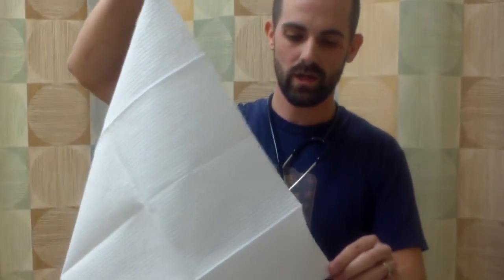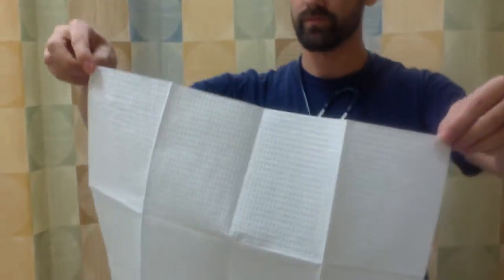Shake that out. Now the shiny side is going to go down. So then I'm going to gently lay this in between the patient's legs. Need a little more space here. So then I'm going to ask the patient to assist me and lift up the buttocks and move the sterile field a little bit closer. Alright, so that's good. Now I'd also instruct the patient to try not to move the legs at all so that they don't contaminate my sterile field, and then I do not have to do this again.